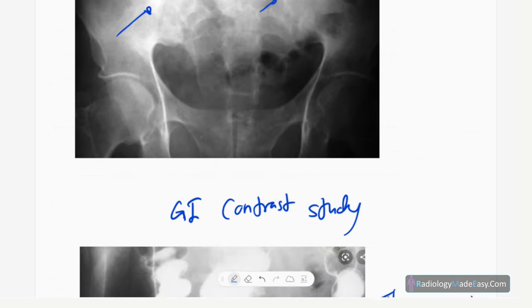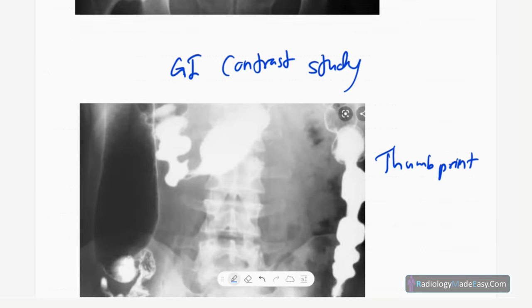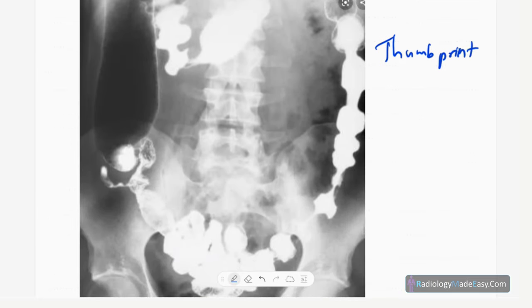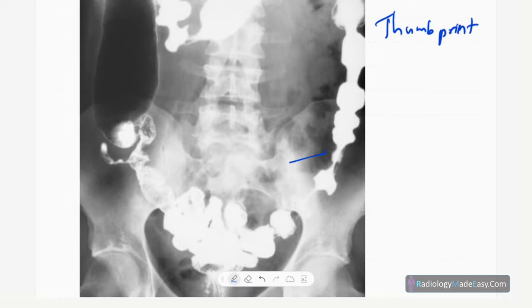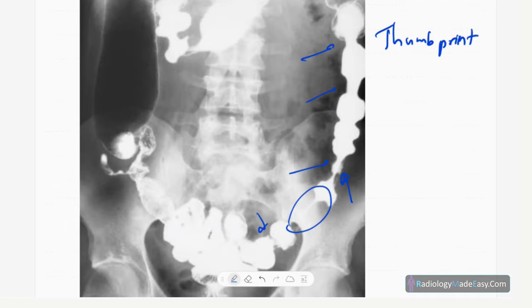This is a lower GI barium contrast study. You can see thumbprint appearance due to thickening of the haustra — multiple thumbprint appearances are visible. There is also a kind of bowel thickening seen throughout.